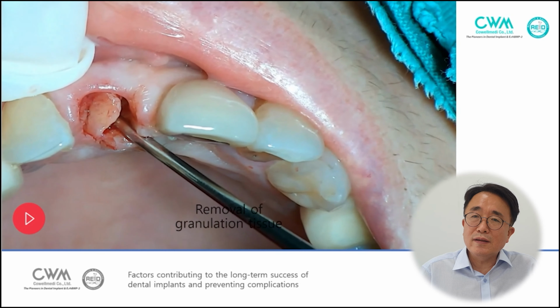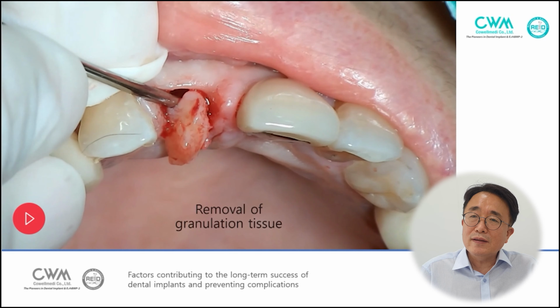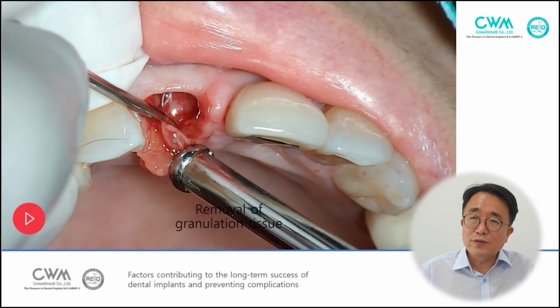So we can remove the well-defined granulation tissue as one mass.